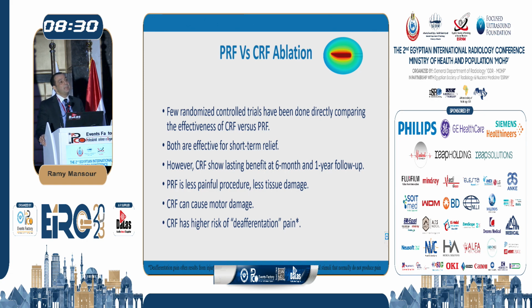The only thing that you need to be aware of, of course, is that continuous kills the nerve. So if it is a motor nerve, you can induce muscle paralysis or muscle damage. It also comes with a rare side effect called deafferentation pain. When there is sudden damage to the nerve, it can cause hypersensitivity. One of the most popular types of deafferentation pain we come across is in patients with amputation, who have this kind of ghost pain or neurogenic pain. So it is something you need to be aware of, that sometimes it can cause extreme pain.